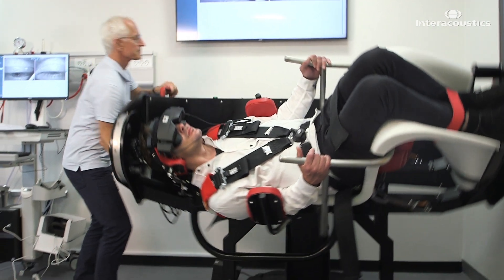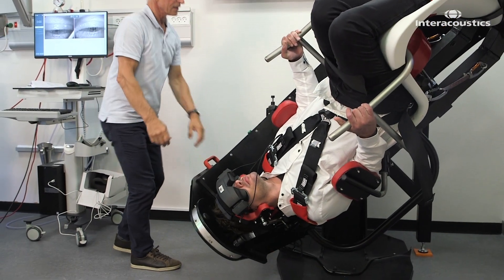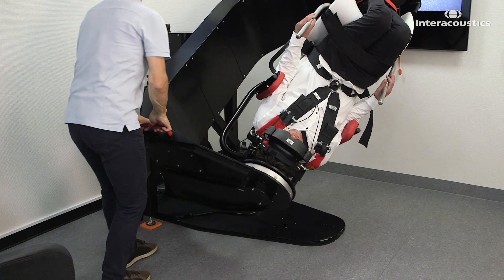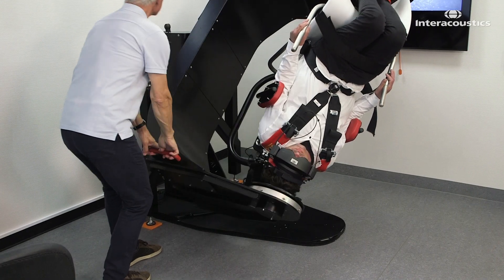Return the patient to the Dix-Hallpike position that came up with a positive test result. Start the test. Apply three rapid decelerations in this position.